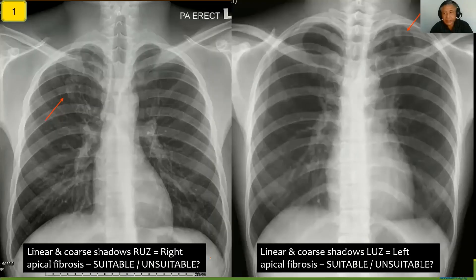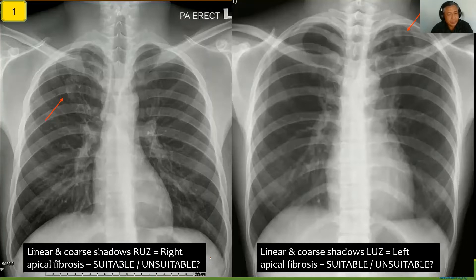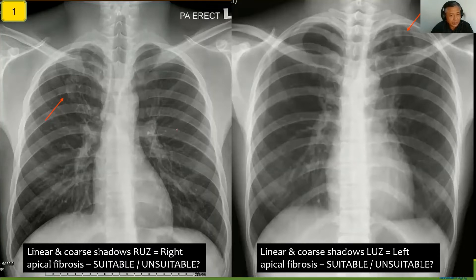Let's look at these two X-rays. The first one on the left — the arrow is pointing to linear and coarse shadows in the right upper zone. This is typical right apical fibrosis, so definitely this will not be suitable. Now how do we determine that there is fibrosis there? If you can see on the left hand side, there are also linear shadows. However, these linear shadows are just blood vessels.